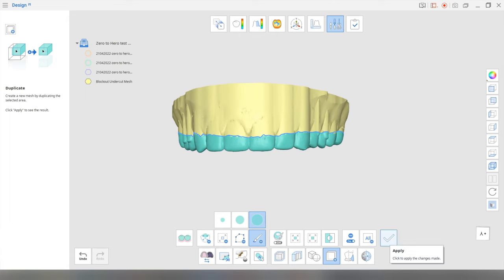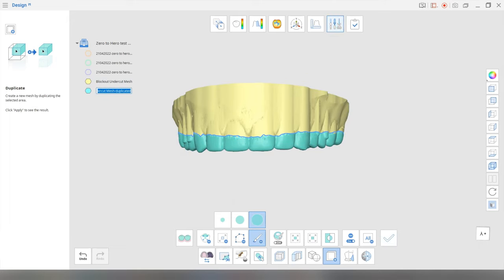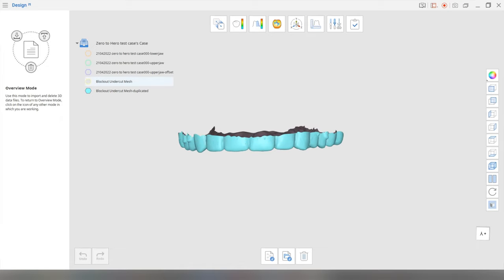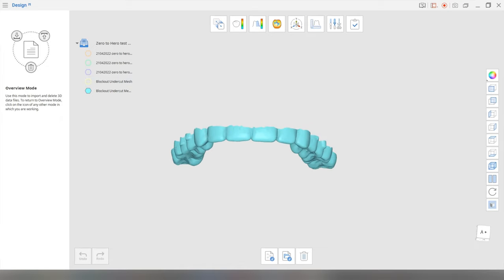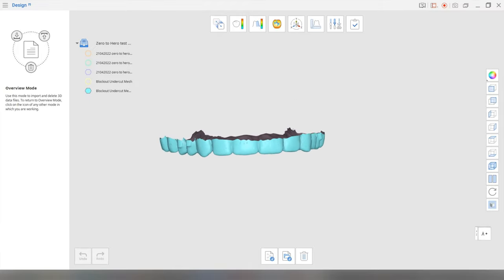So then after you're happy, you're going to click apply. All right. So I'm going to hide all of this. Let's remove that. Okay. So that's your outline of this splint. Okay.